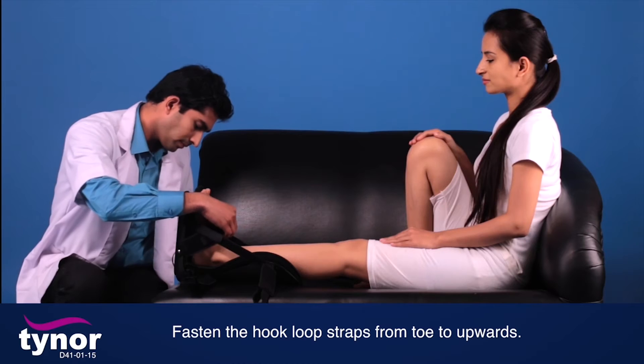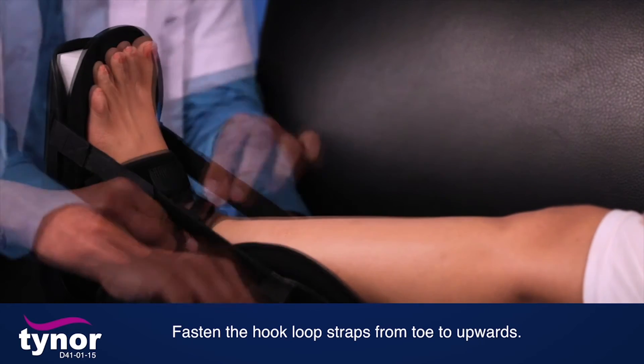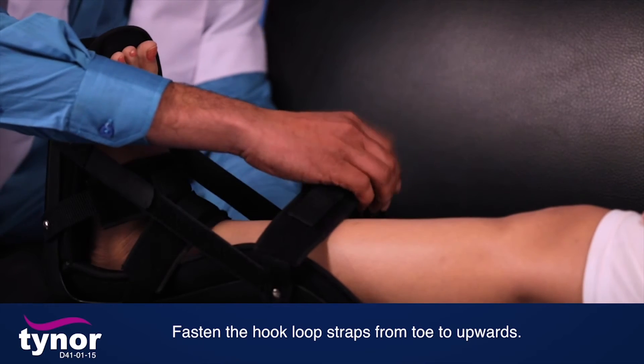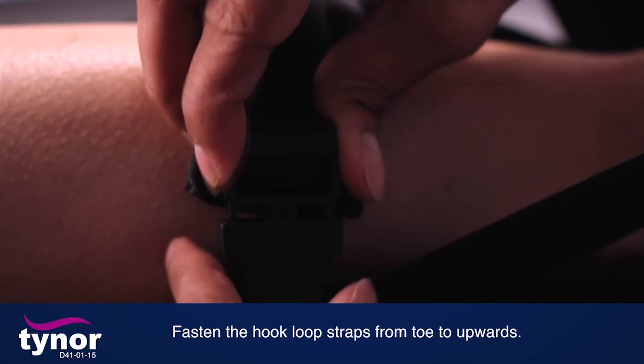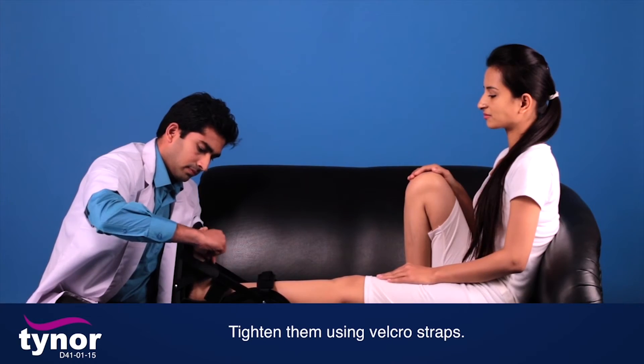Fasten the hook-loop straps from toe upwards. Check if the hook-loop straps are found loose; tighten them using the velcro straps.